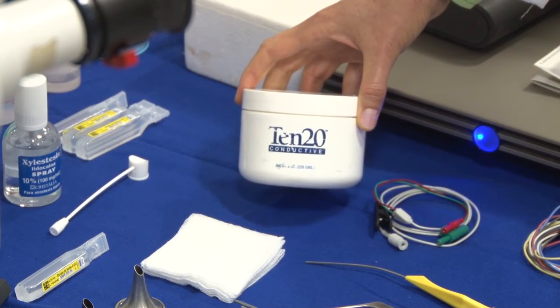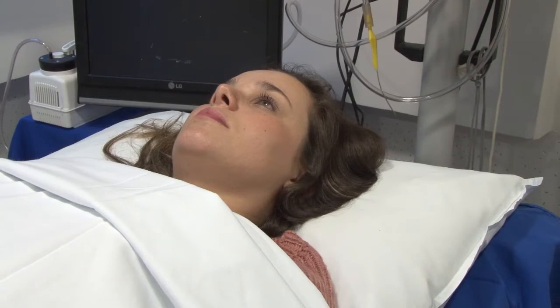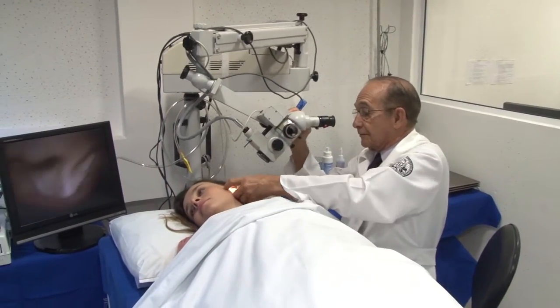We need surface electrodes and NuPrep for skin preparation, like for a traditional ABR test. Now we show you the patient preparation. Be sure that she is in a comfortable position — a pillow may be helpful. First of all, we use the microscope for a careful otologic examination. All earwax and debris must be completely removed. You should be sure to see every single aspect of the tympanic membrane. Special attention to perforation, which sometimes may be very tiny, but must be identified before going on. The ear canal is fine, the tympanic membrane is normal — no calcifications, no perforation, no retraction pockets.